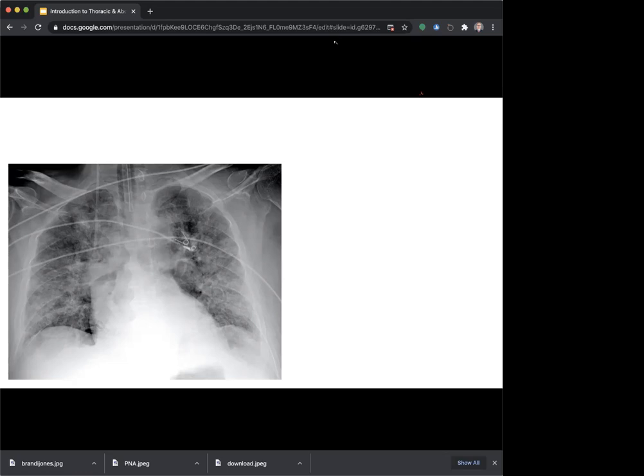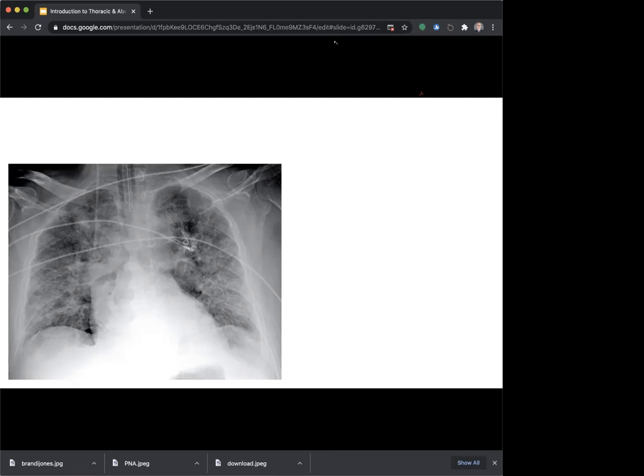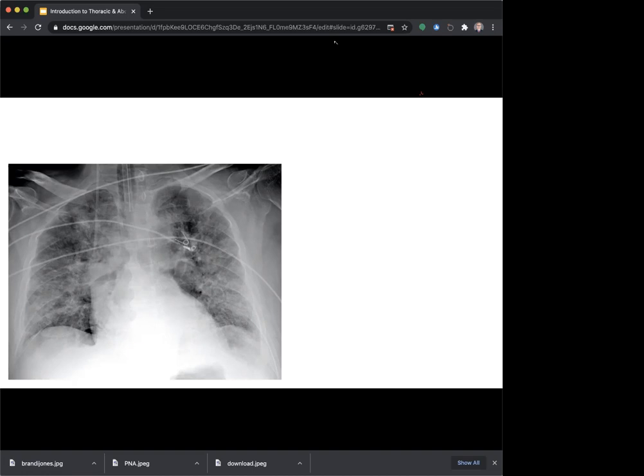Looks like definitely some wires going on. There's definitely some wires. This patient looks like they're probably hospitalized. Yeah. How do the lungs look though? Diffuse opacities, maybe a little, I don't see the heart borders really well. You hit the nail right on the head.